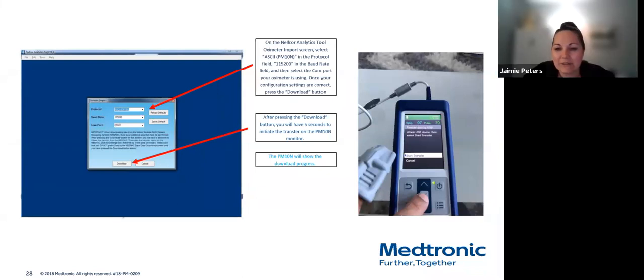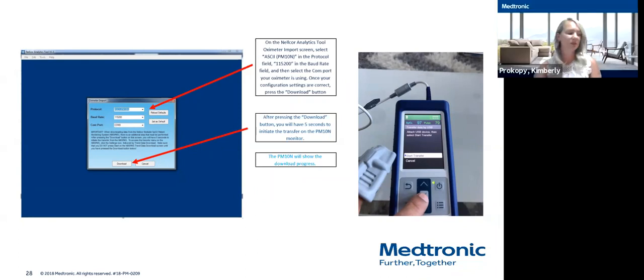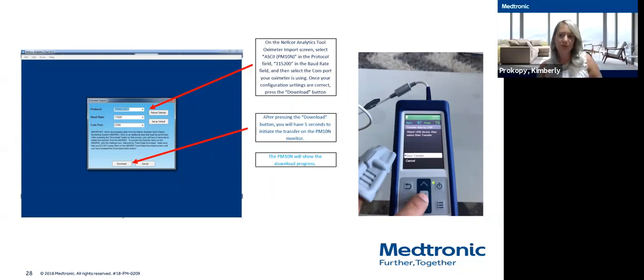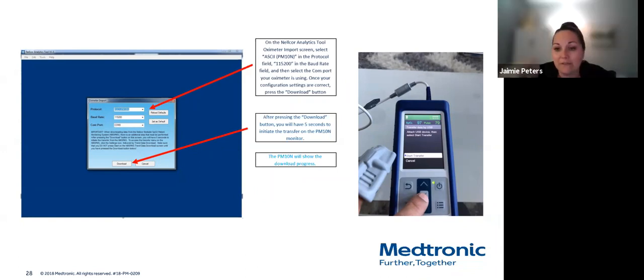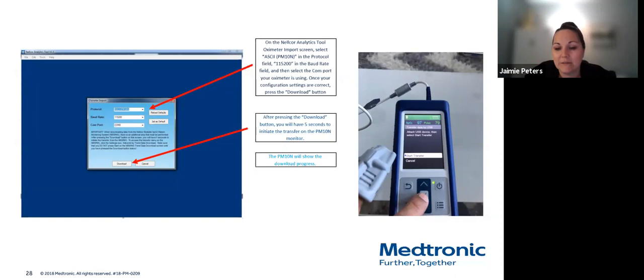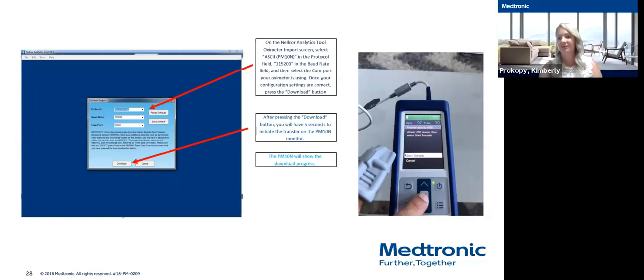I like this oximeter a lot because when we do exertional testing, you need to have 20 seconds of desaturation period of time. It's kind of cheating the system, but you're supposed to have that 20 seconds. If you're spot checking every 5 seconds or so, you can choose the moments where you want to spot check. So if it bumps up to 88, don't spot check it at that point. You spot check it when it drops a little bit, and that lets you sort of bypass. I shouldn't be encouraging that necessarily, but it makes it more useful because those people do need oxygen. It's just that moment of time where maybe you're not getting that little bit that you need.